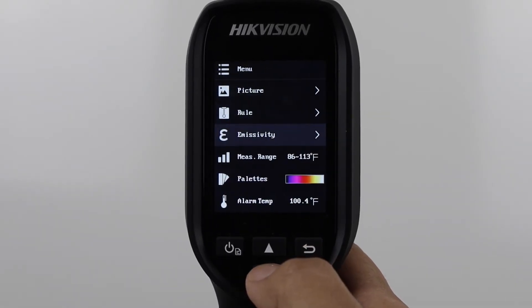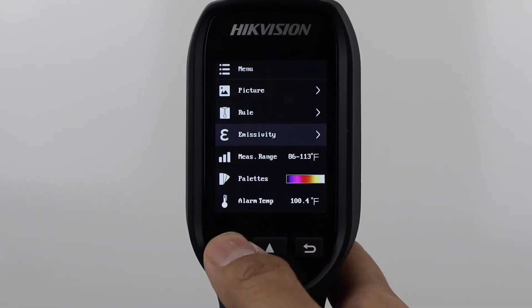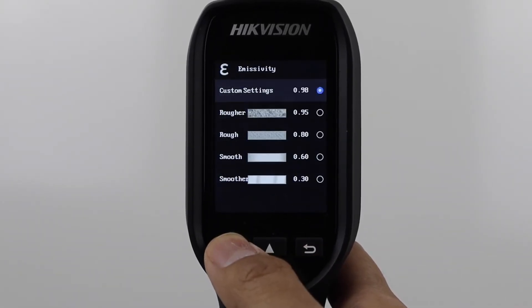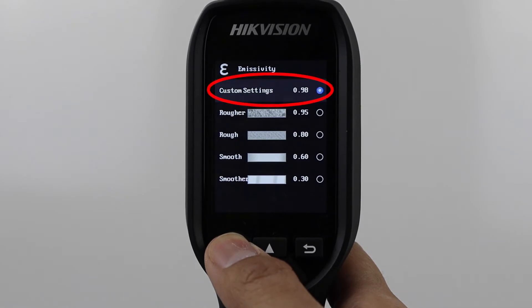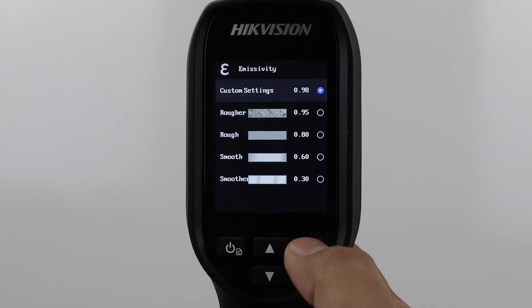Next is Emissivity. For human body temperature, this should be set to 0.98. Other settings are used for other applications like building inspection and don't apply to body temperature.